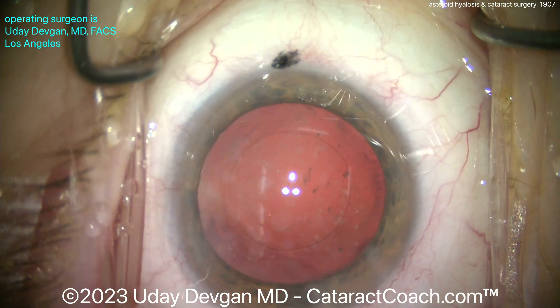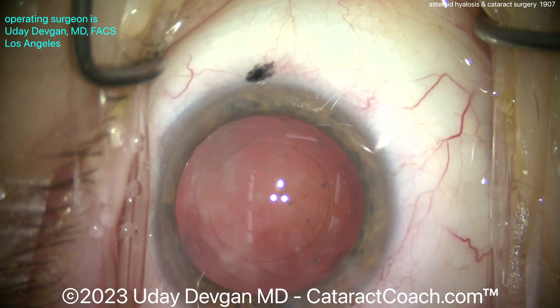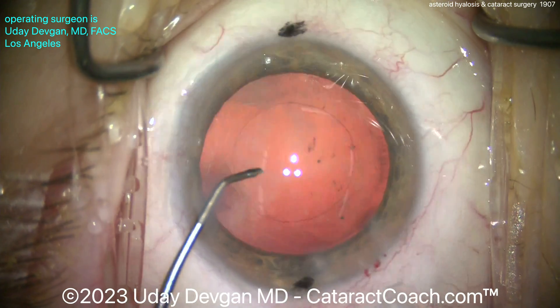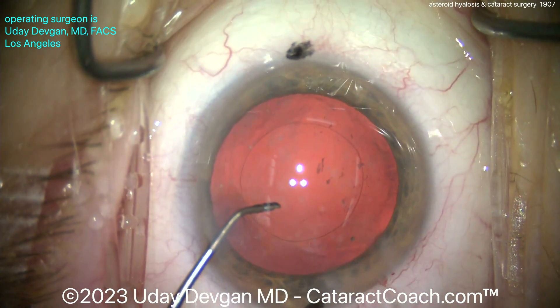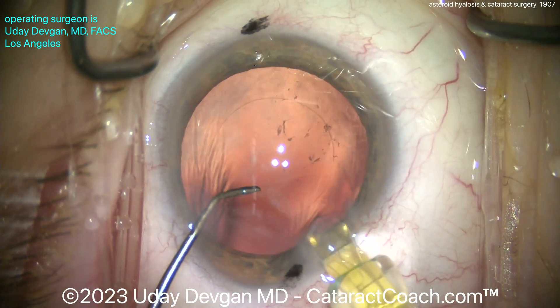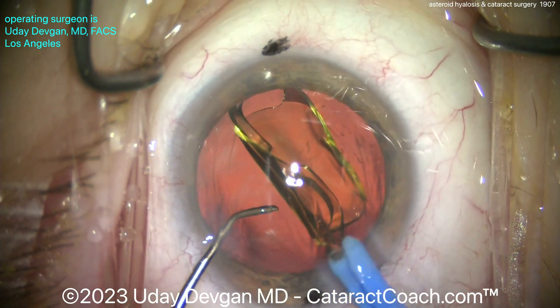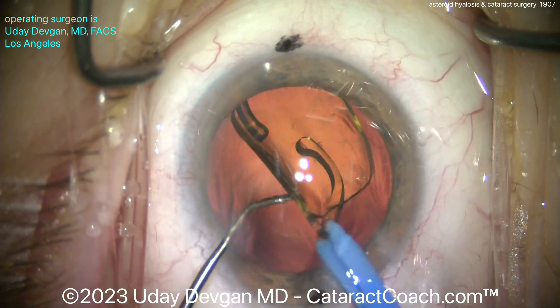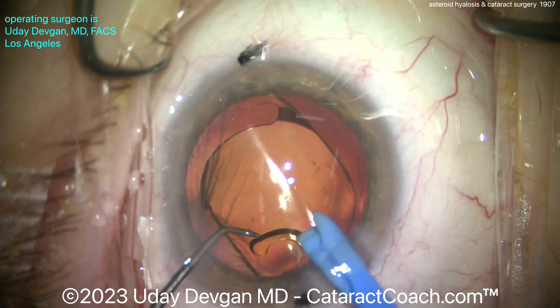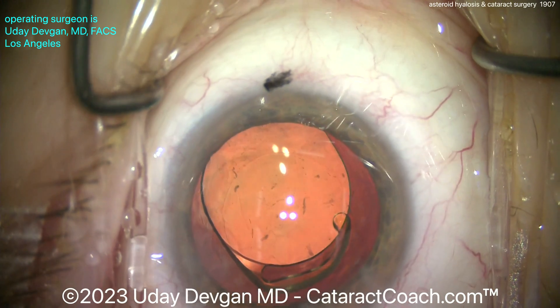The patient has this condition in both eyes to about the same degree, and again it's totally asymptomatic. You can see all those little refractile bodies — there are a lot of them in there. In a case like this, I think you could put in basically any lens you want. I tend to choose a monofocal to maximize the amount of light hitting the retina in focus and avoid splitting it up too much. But if you decide the patient is best served with a trifocal, multifocal, or EDOF design, you can go for it — as long as you explain things to the patient.